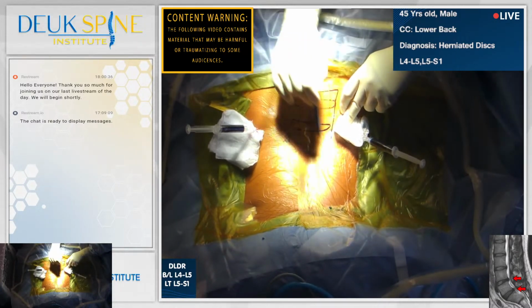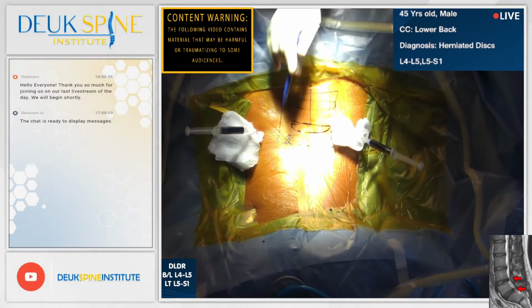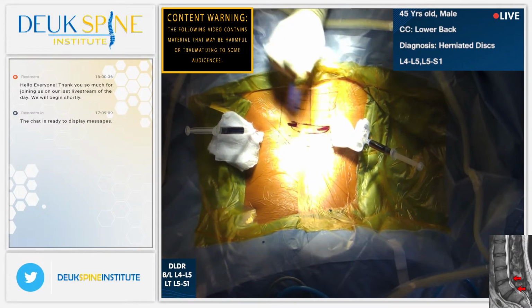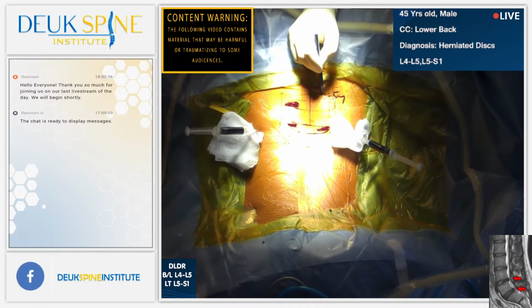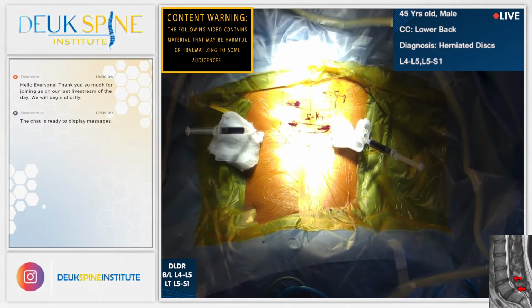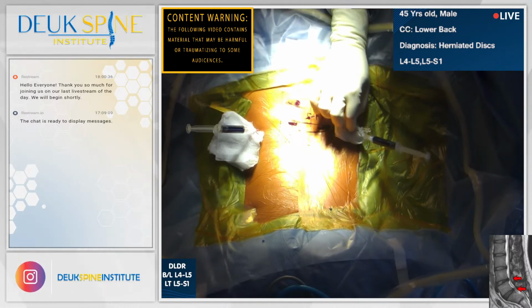He showed me this area right here in his back. And I looked on his MRI and there were two discs, L4-5, L5-S1. L4-5 had annular tear on both sides with herniation on both sides. And the L5-S1 was really off to the left. But I knew these were the cause of his pain based on my experience in treating thousands of people and eliminating their pain with this procedure. So I said, I think this is the way to go. He's here now to get his surgery done.